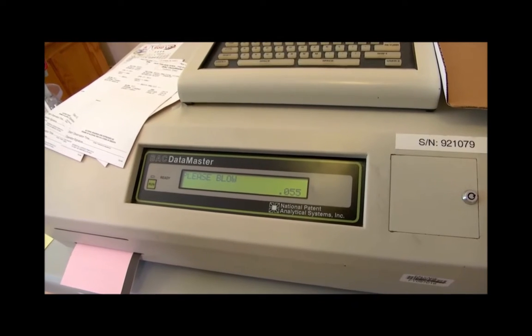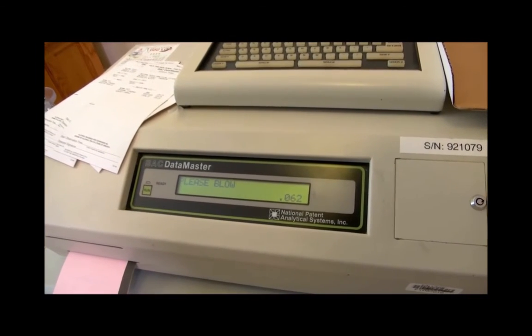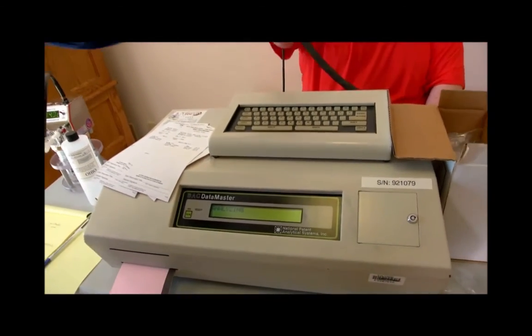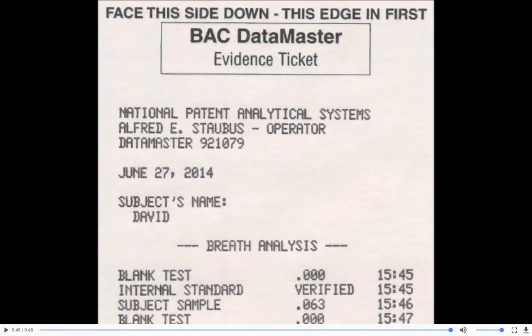Notice the longer he blows, the higher the test result is. At this point, he's exceeded the minimum volume needed, and looks like he's around a 0.06 something. And he could have stopped. 0.063 is his test result there. Alright, so you can kind of see the numbers rise quick and then slowly level off. I don't know if you can really see them level off. They weren't rising quite as quickly towards the end, and that would be representative in that slope that I showed you at the beginning.